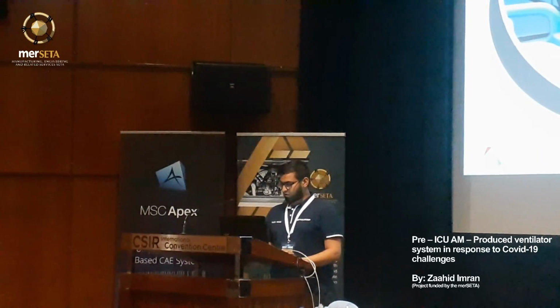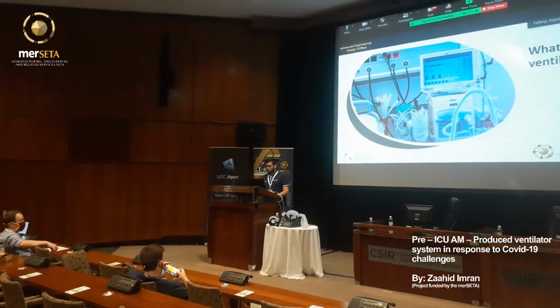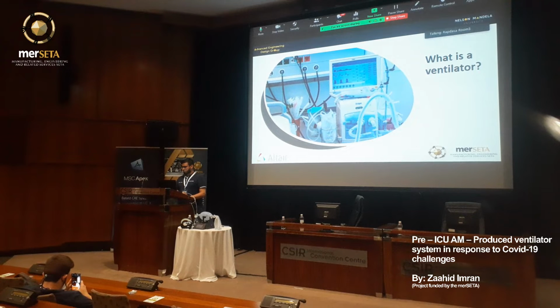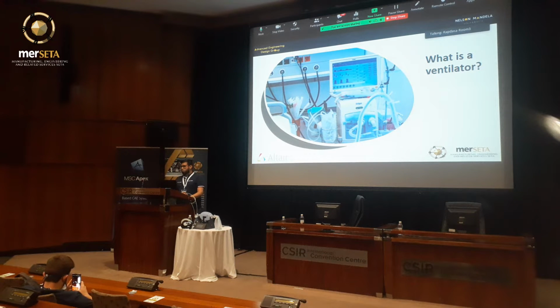Okay, so just before moving further, let's start off by looking at what ventilators are. A ventilator is a machine that helps the patient breathe if the patient is unable to do so by themselves. It pushes air and oxygen in and out of the lungs. These ventilators are normally referred to as mechanical ventilators or resuscitators. The main function is to take over the breathing system of the patient while the patient is fighting off infection. A ventilator is essentially a pump delivering air by positive pressure to the patient.